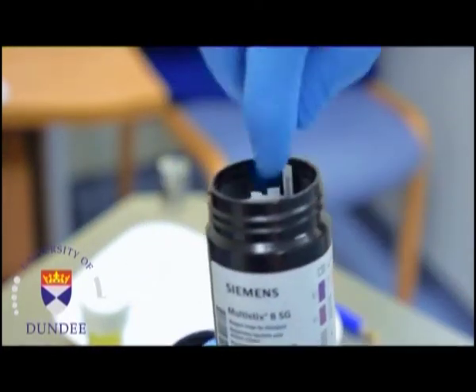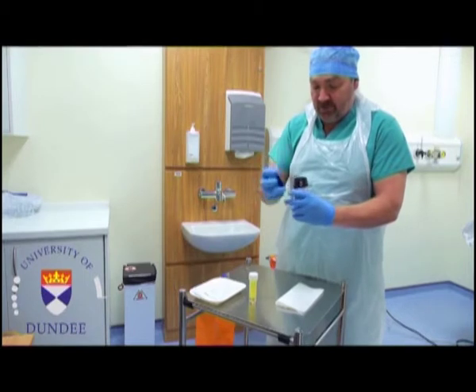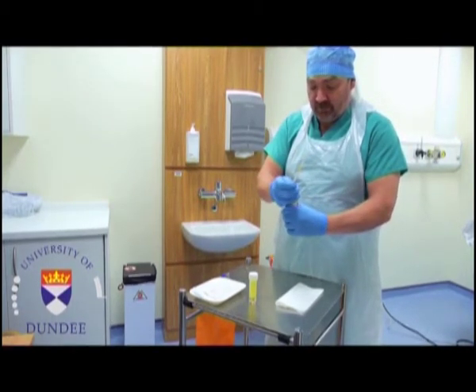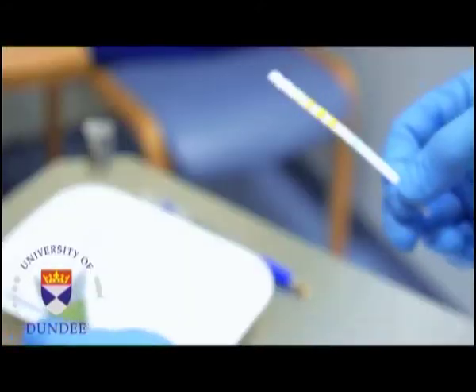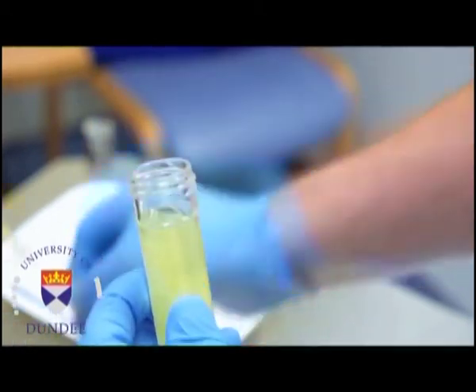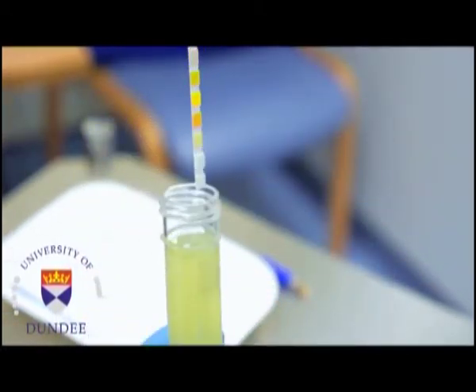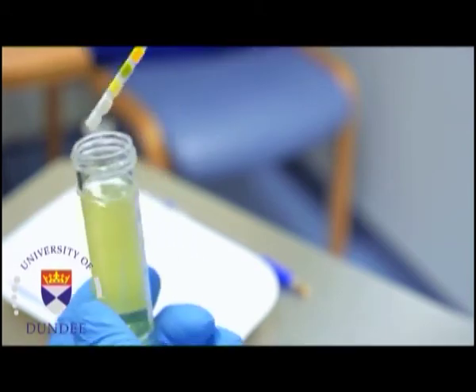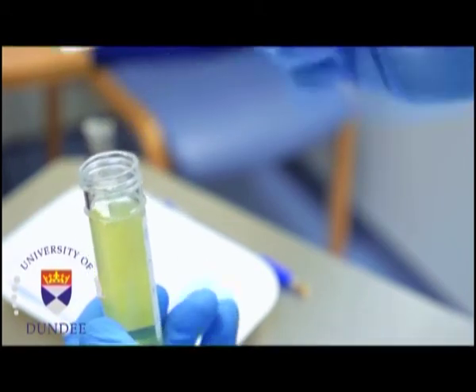Urine test results should always be interpreted using the reference range provided by the laboratory that performed the test or using information provided by the test strip or device manufacturer. In addition to various substances, other tests include a description of color and appearance.